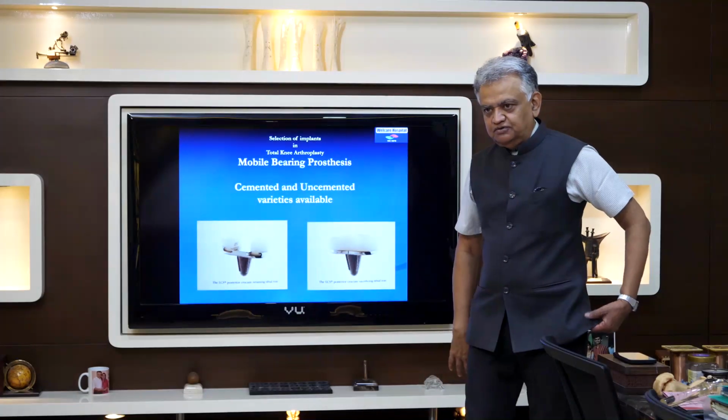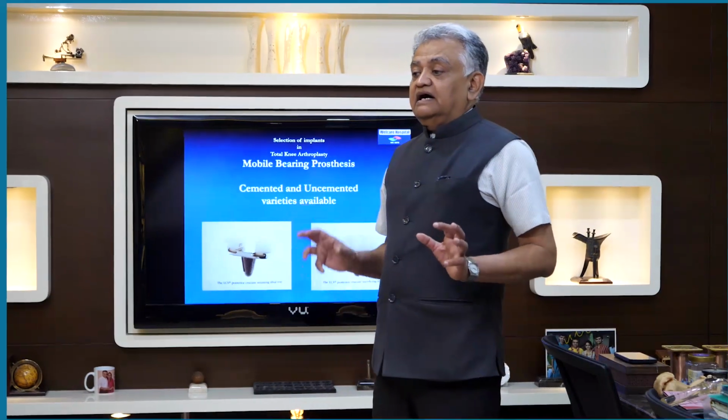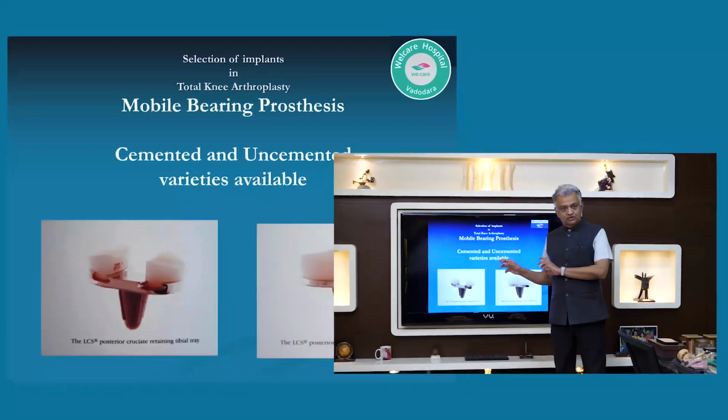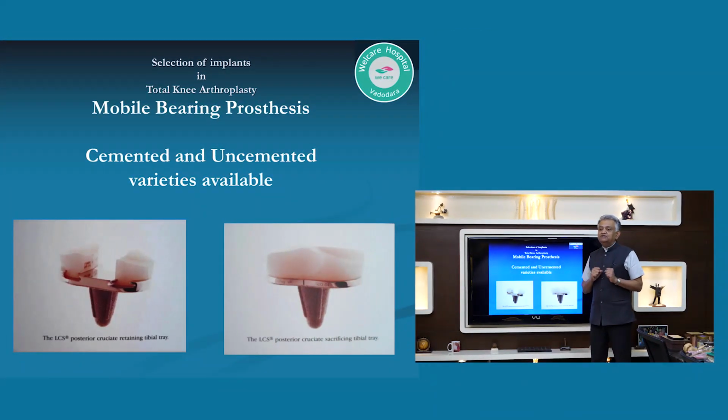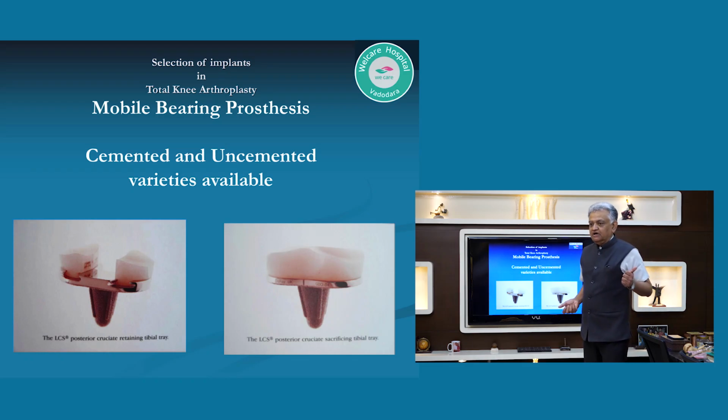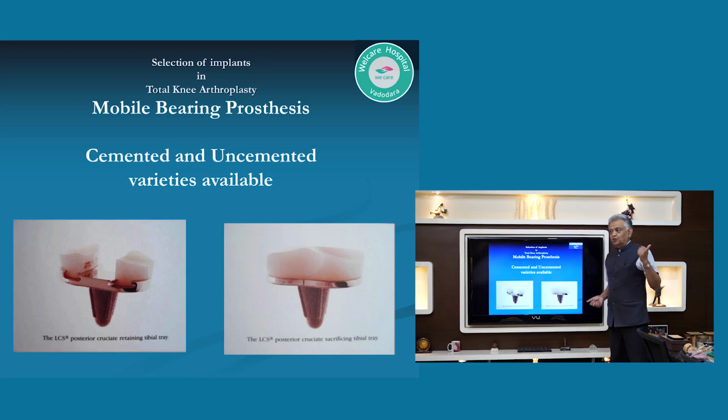So now we come back to the main lecture. I just wanted to bring in the science of poly, at least briefly, to make you understand how important it is to understand all this when you are selecting an implant. Selection of an implant is not about my boss used to do this and that's how I know, and that's why it's best. Or that it's the cheapest implant available to me. It's about understanding why. You might eventually be influenced by the commercials of the issue, but you should be aware of the science first and then factor in the commercial.